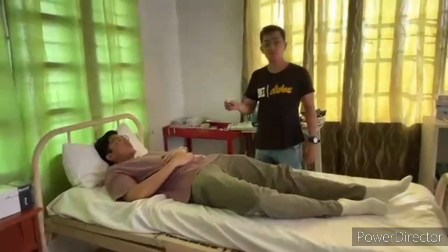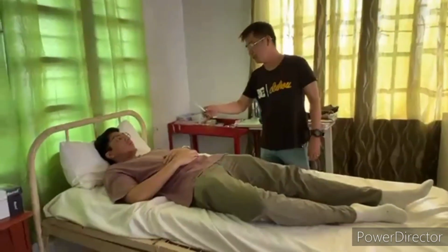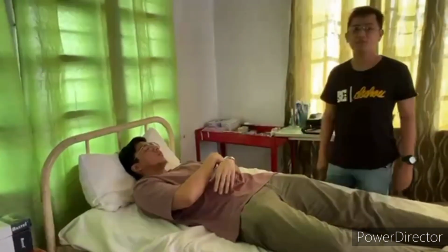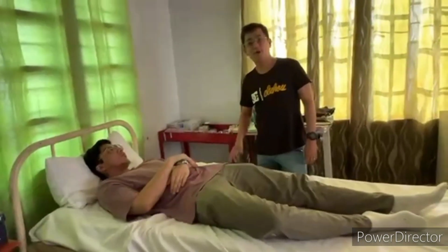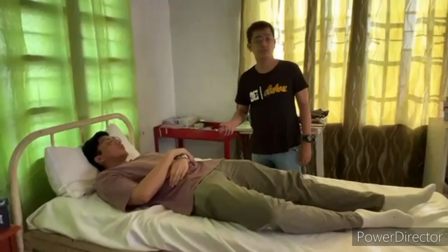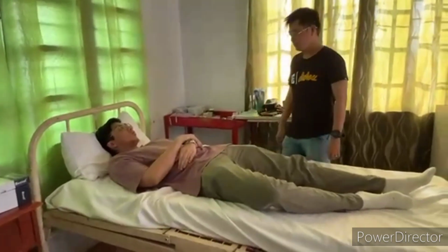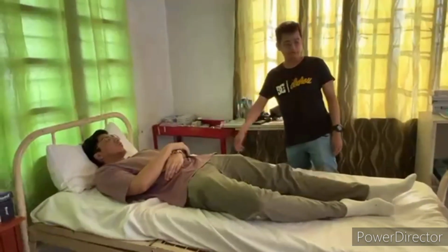Okay, asking the patient to put it under the axilla of the patient. Hey sir, can you put the thermometer, the tip of the thermometer, under your axilla or under your armpit? Make sure that you tell the patient to make sure that the tip of the thermometer won't touch the gown of the patient or the clothes of the patient for us to be able to get the accurate result of the temperature. Okay?